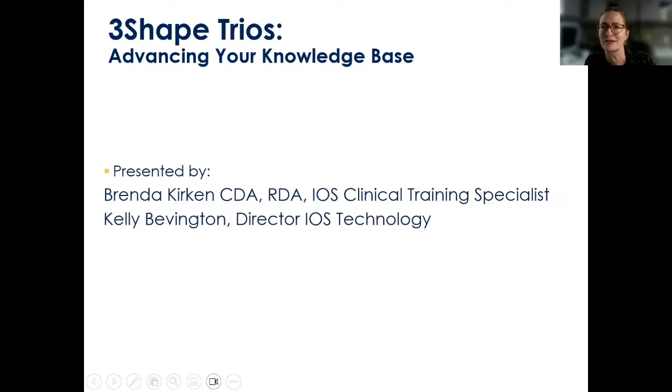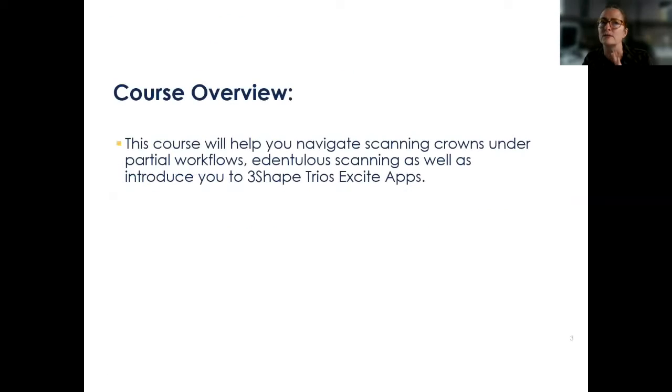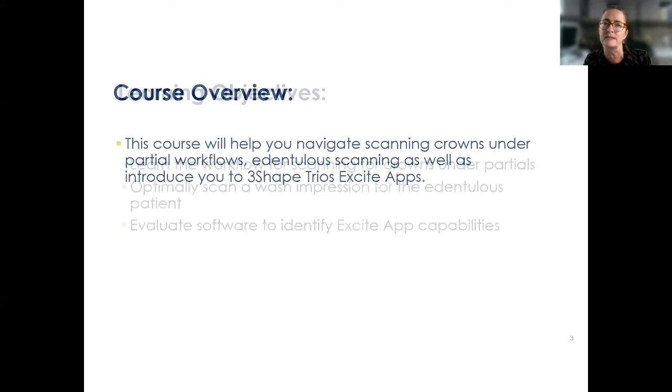Thank you. Thanks so much, Jessica. So tonight it's advancing your knowledge base. I just want to go over the course overview. So this is what y'all registered for and what we're prepared to educate you about. Tonight is going to be about scanning a crown under a partial, doing some edentulous scanning, as well as introducing you to the 3Shape Trios Excite apps.